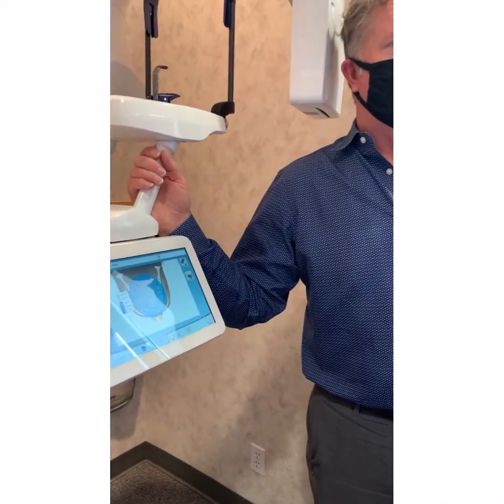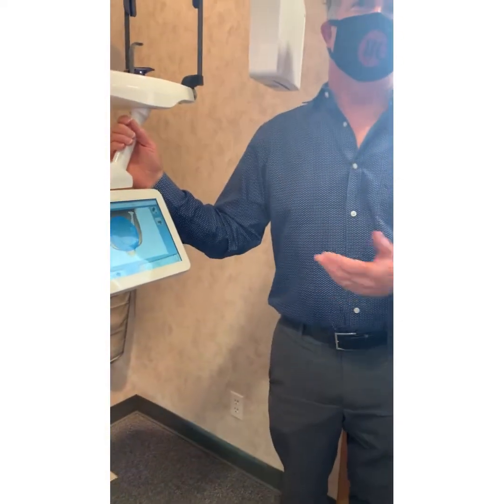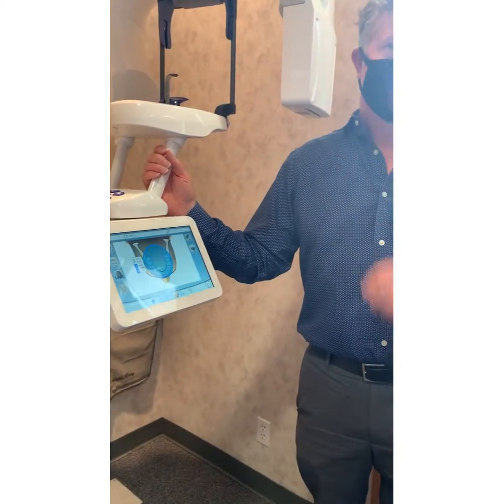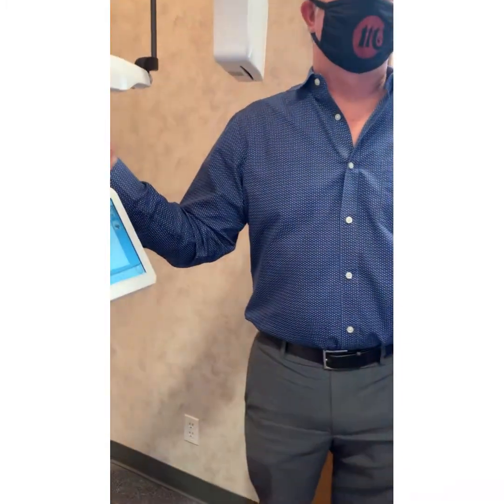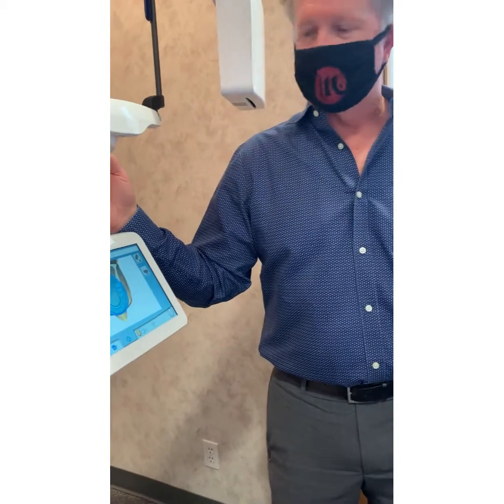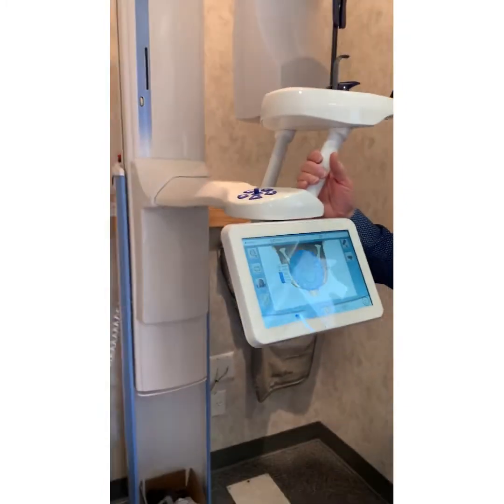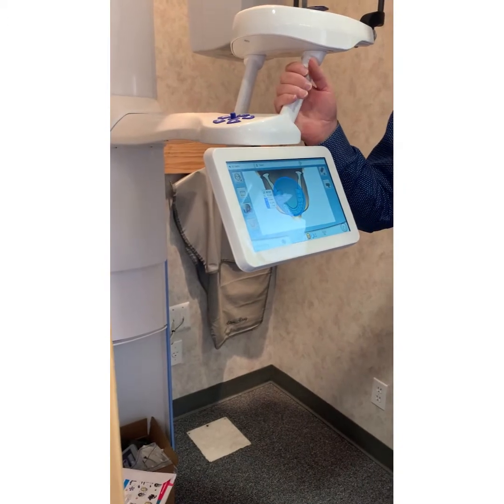Not here. I think the only precedent here is that if you are placing an implant and you didn't take a 3D scan, then if something goes wrong, that's a problem. The rule is, if you take a full mouth, upper and lower arch, you're obligated. If you take a half arch, you're not obligated. Oh, really? I've not heard about that being the case here, but okay. There are plenty of radiologists here in Southern California. You don't have to send to beam readers. You could find somebody here that does it for dirt cheap. She met Francisco Arasso years ago, so that's why she wanted to send to beam readers, to help him. They're no better than anybody else.